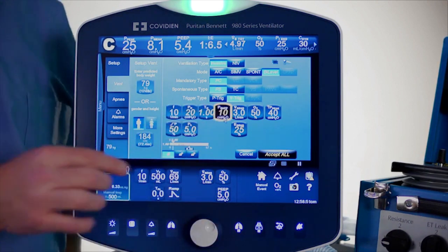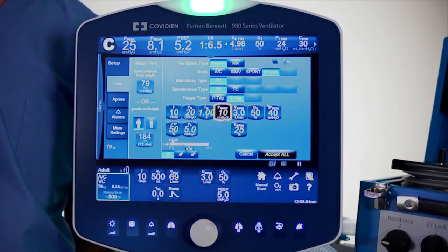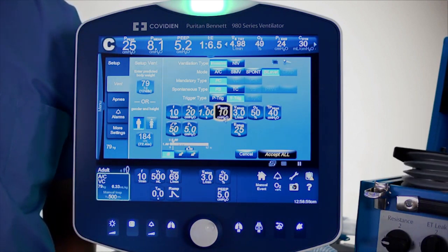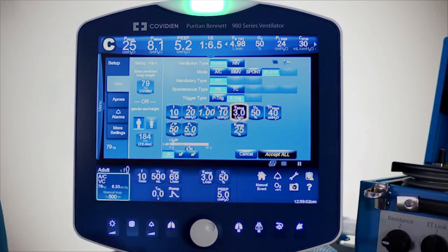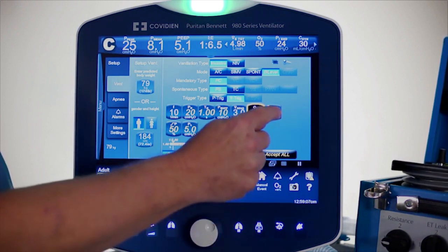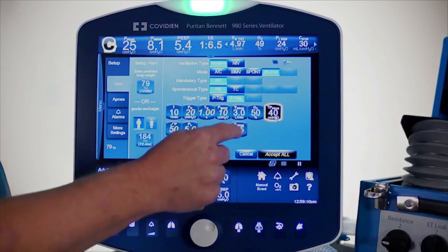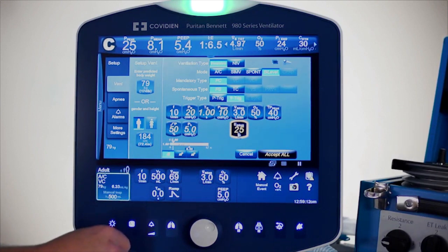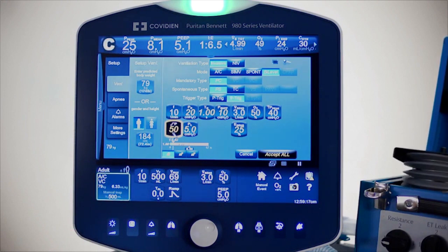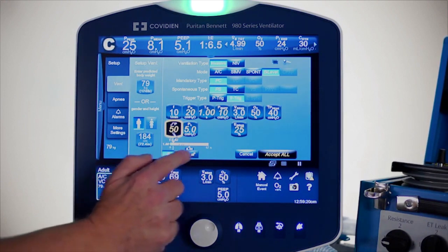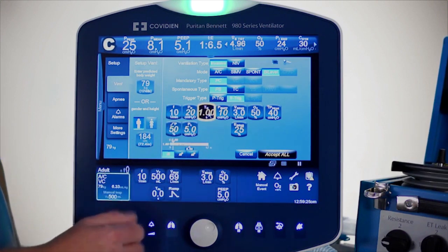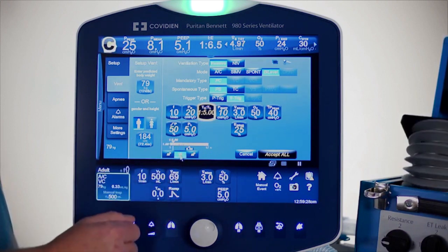That pressure support is on top of PEEP. With 5 of low pressure plus 10 of pressure support, that's a total of 15. Moving on to traditional settings: flow sensitivity, O2 percentage, high pressure limit, and expiratory sensitivity — which is related to the use of pressure support. It is a pressure control, so there is a rise time. Down below there are locks, so the question is what is the most important variable to set — inspiratory time, IE ratio, or release time?